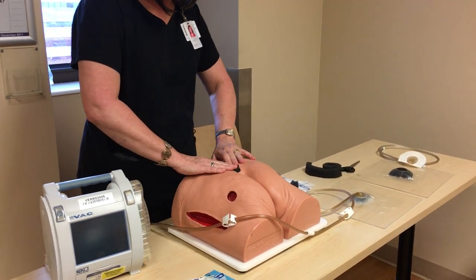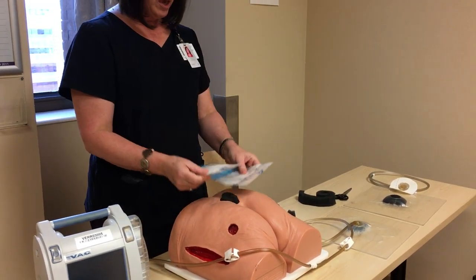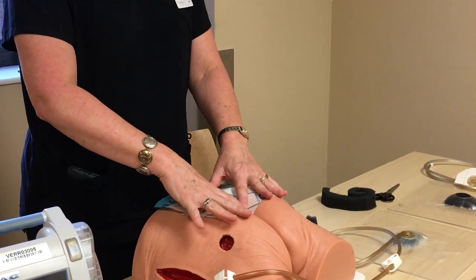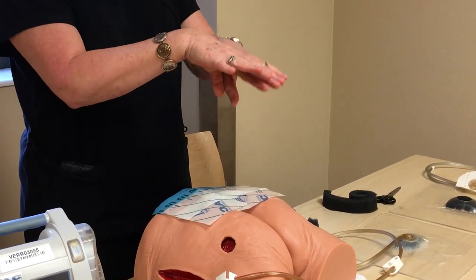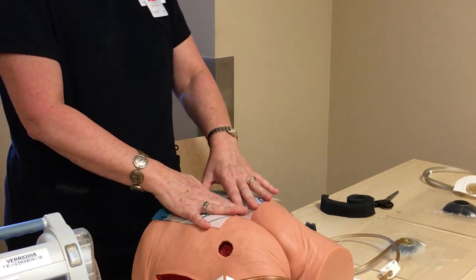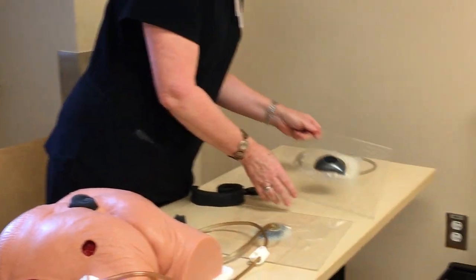Once you get the foam into the wound, you take your drape and seal the wound off. Most people like to do a shingling technique, just because you make sure you get that nice good seal, especially if it's in the sacrum area. Once it's sealed off, this is what your dressing will look like.